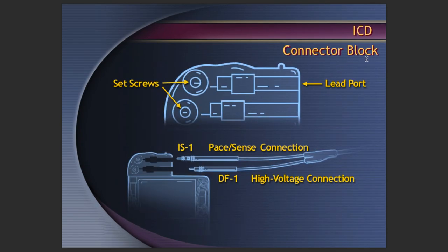For example, even in the connector block, if you look carefully, this is the port through which the leads are entered. And similarly, then come the set screws over here, okay?